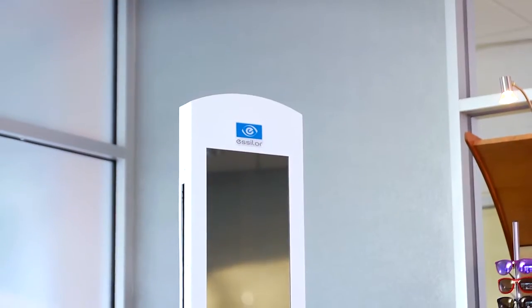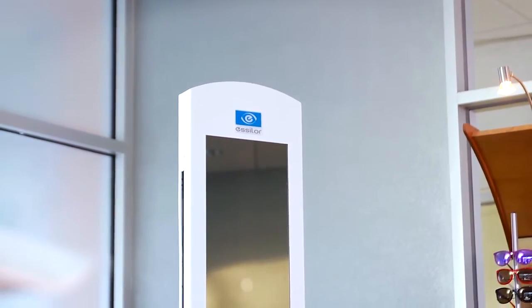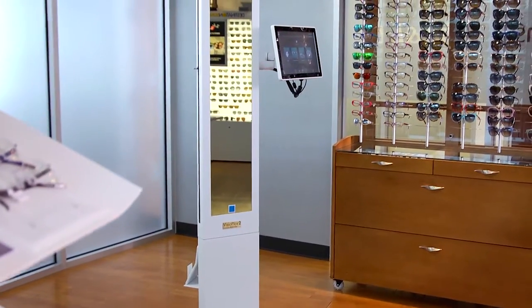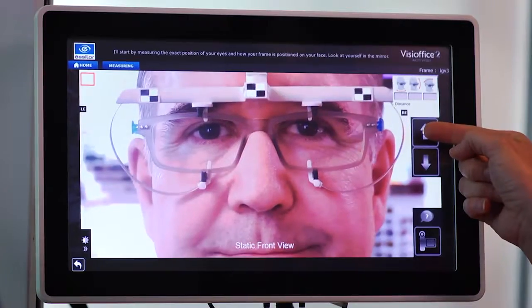Welcome to the VisiOffice 2 system. By following these simple steps to personalized vision, you can give your patients the best possible vision experience. Let's get started.